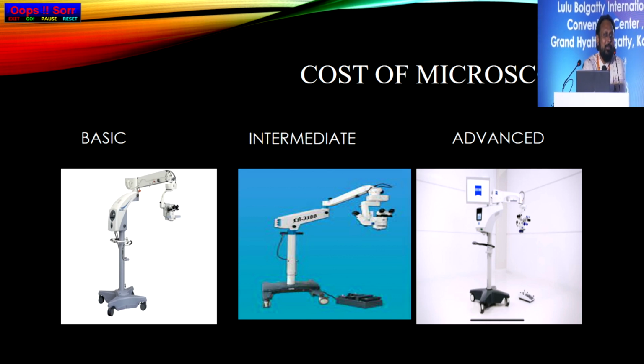As Jensen said, the previous models are all very sturdy. So we still have microscopes which are 10 years old, 15 years old, from Haag-Streit and Lumera, in our practice. But the newer ones that are coming don't last that long. So my suggestion as far as equipment is concerned, when you're starting your practice and it's going to be a single equipment investment, it should be only new, because as Jayantan said, what you buy is going to last for the next 5 years.